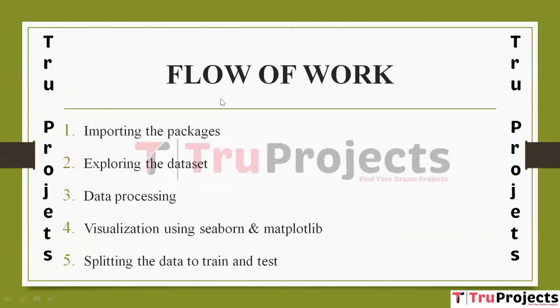Flow of work. To implement this project, we have designed the following modules. The first module is importing the packages. In this module, the necessary Python libraries and packages are imported. These libraries include data manipulation tools like NumPy and Pandas, machine learning frameworks such as scikit-learn and TensorFlow or Keras for deep learning, and data visualization libraries like Matplotlib and Seaborn.